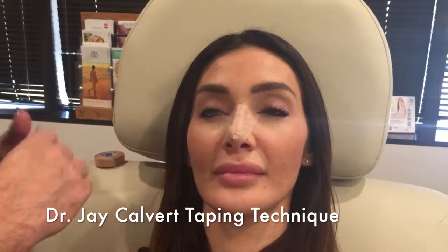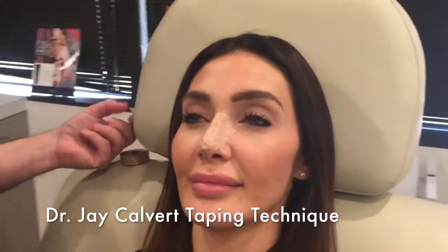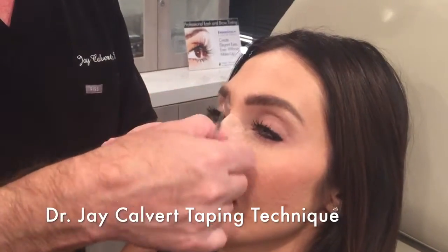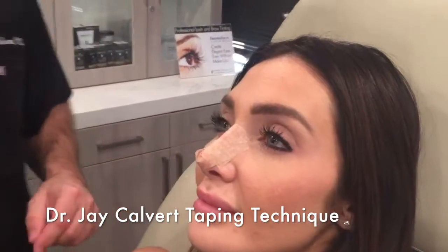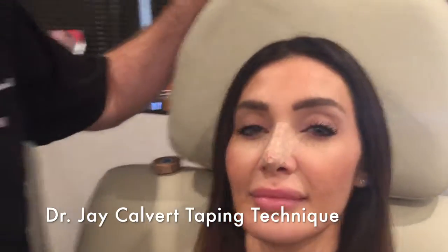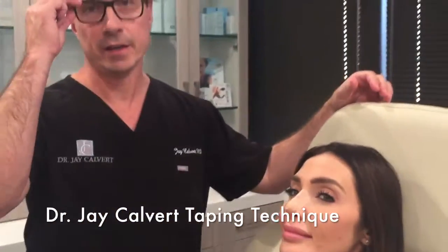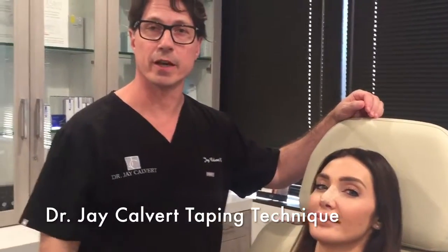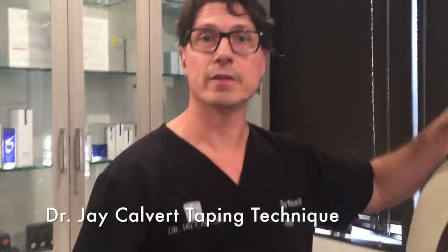You can trim this little beak if you want to or just leave it in place. Then I use one other piece just to lock that tip tape over the nose. With this in place, you're able to get good compression. This is done typically at night. You can tape it in the day for the first three or four days after the dorsal splint has been removed.